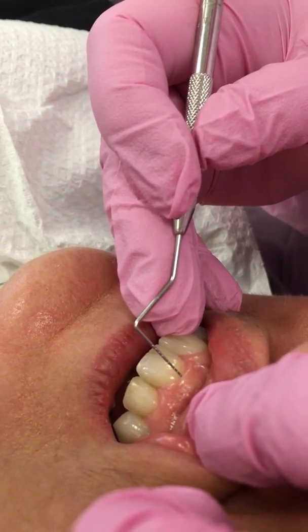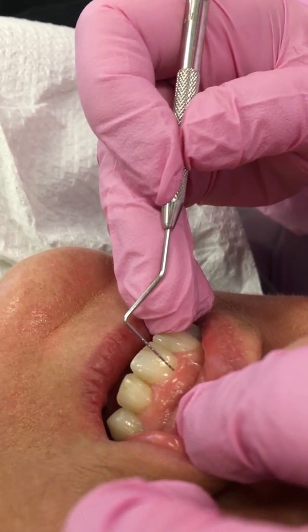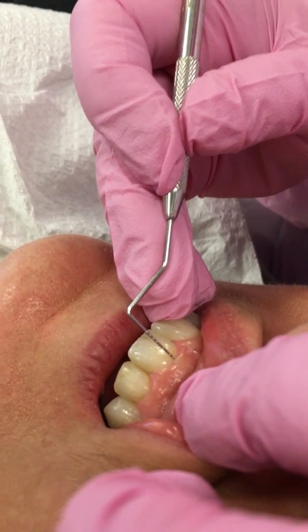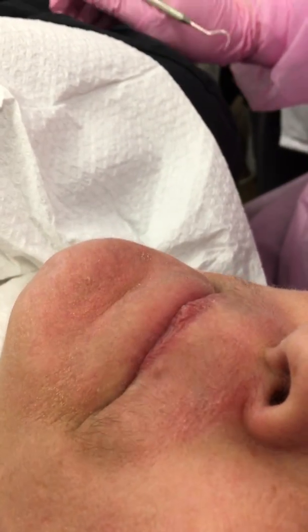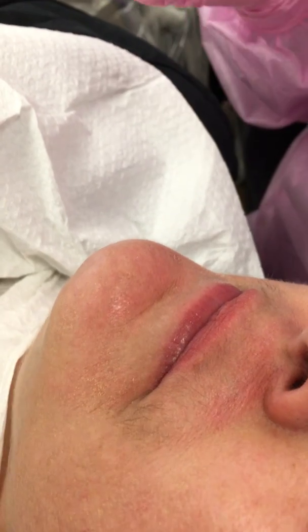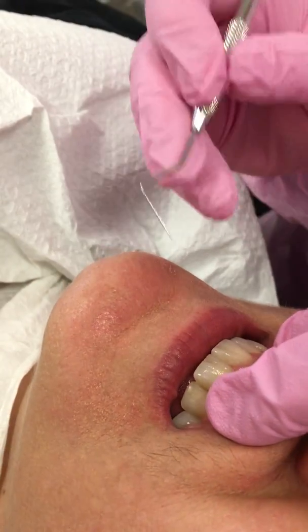And so I am probing into the sulcus, and what I've done is I've taken the nib, which is the end, gone down along the tooth, worked it under the gingiva until it stops, and it feels like when you push on your skin. That's what it feels like. Okay, it doesn't feel like a rock. If it feels hard, then what we're feeling is calculus, right? All right, so then we want to go around it.